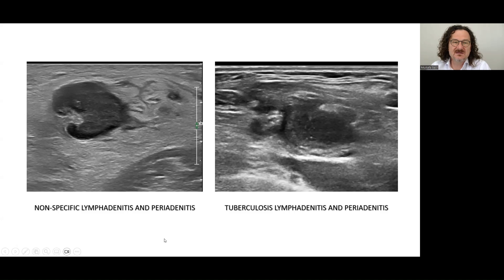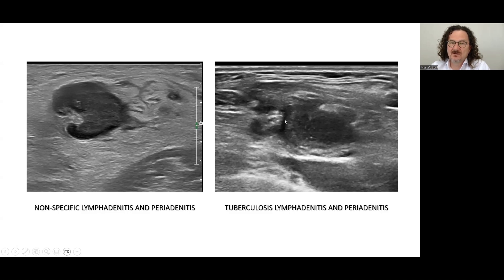This was a lymph node in the inguinal area which was painful. You see the margins are lost and speculations here. This was a tuberculosis patient — you see the diagnosis by operation, showing periadenitis and the rupture of the lymph node.